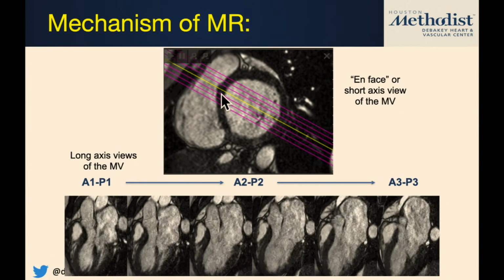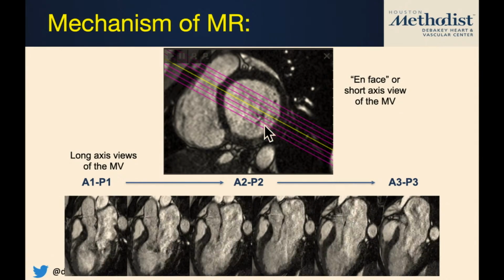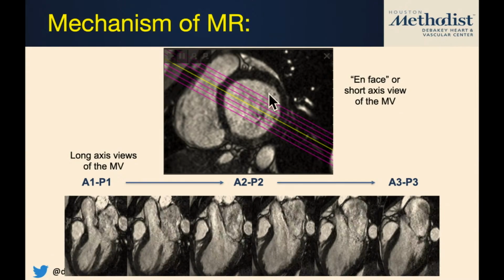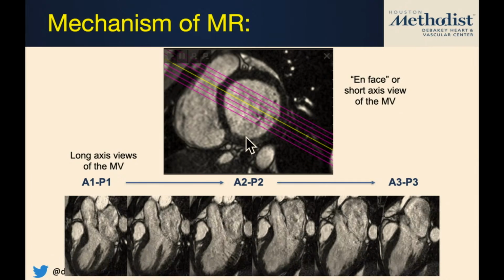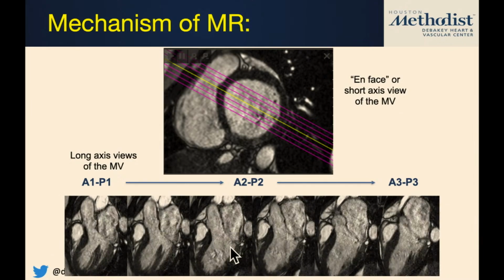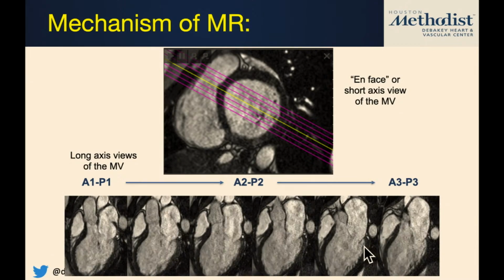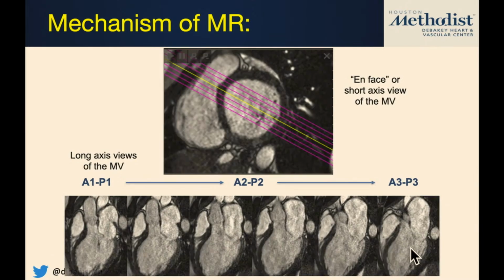Well, instead of just getting one mid-ventricular three-chamber view, our goal is to really get a series of these, a stack of these three-chamber views that go through the more anterior interfaces, which would be the A1, P1, as well as more inferiorly, which would be the A3, P3. And as we go through and look at these and look at the coaptation, you'll notice that the primary coaptation abnormality is down here when we get down to the very inferiorly near the A3, P3 interface.